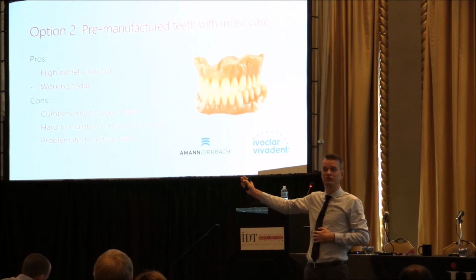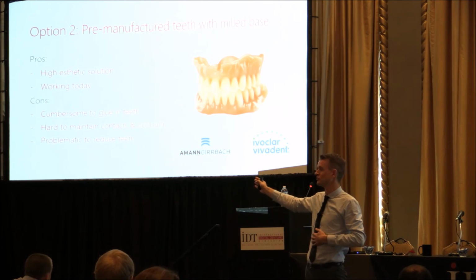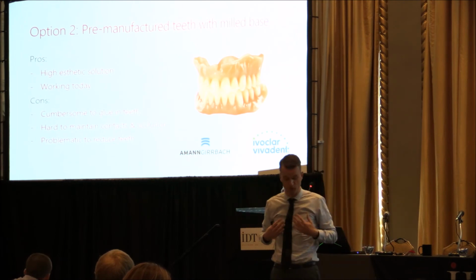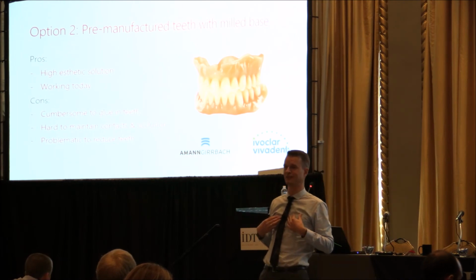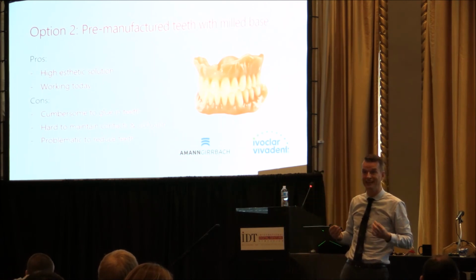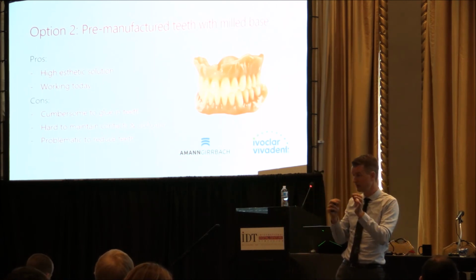If you want to do pre-manufactured teeth, we have the solution for you. You can go ahead doing it. You will face some challenges. I also think the teeth manufacturers, we'll be happy to help them because we have no preference for our method, but we'll be happy to help them to improve this workflow. But today it is a little bit tricky, in my opinion, because of these things.